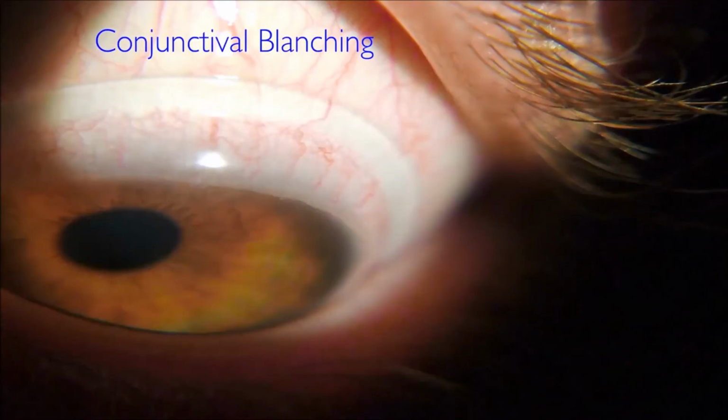If the patient puts the lens on or you apply the lens to the eye with a little excessive force and you create negative pressure under the lens, you can create blanching that looks like this. When you're putting the lens on the eye, you want the lens to be drawn up to the eye. You don't want to press the lens into the eye.